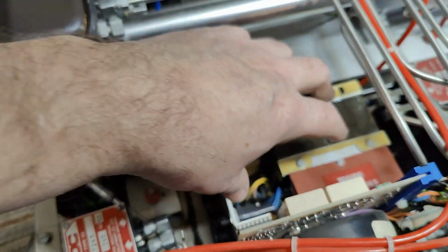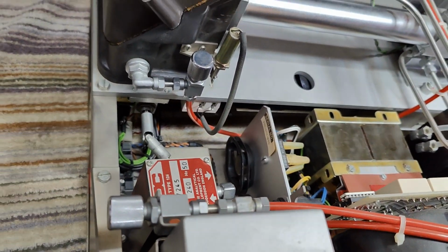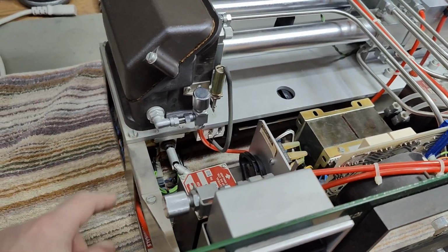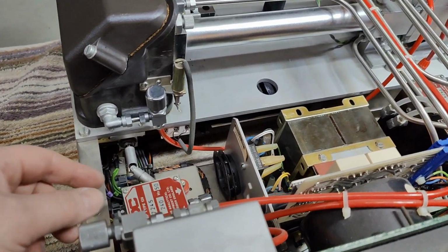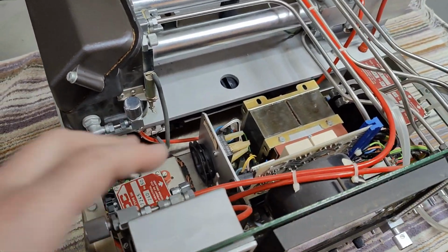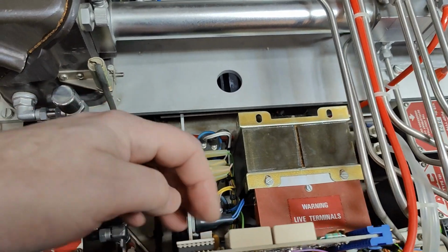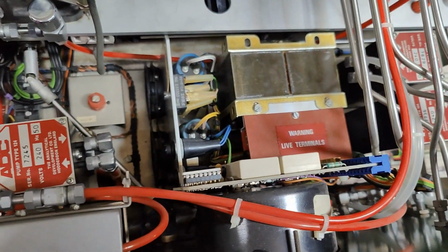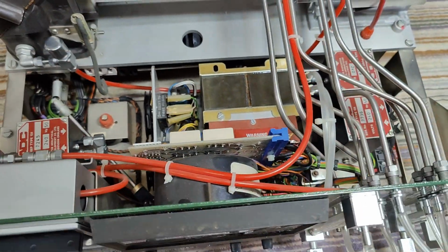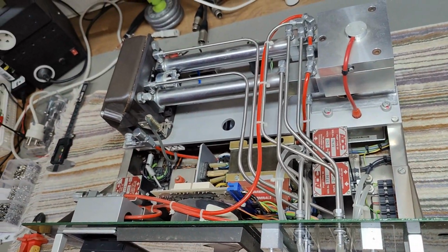And there's a huge linear power supply, and yeah, we also got a lot of interesting stuff down here under that one. So I'm definitely going to pull this to a million pieces and probably figure out what it contains. Oh, the circuit board. We got some IC, so I can probably date it, and some interesting stuff here. Yeah, let's begin pulling this apart.